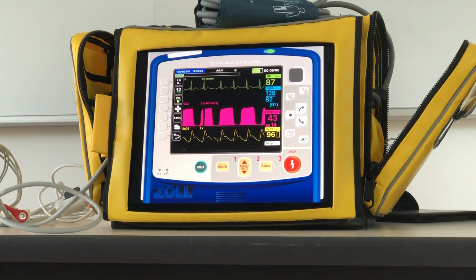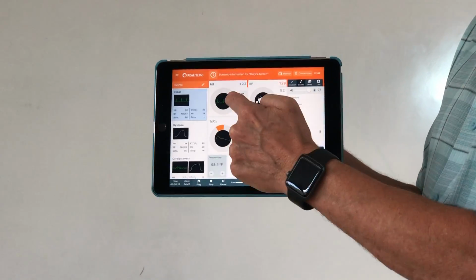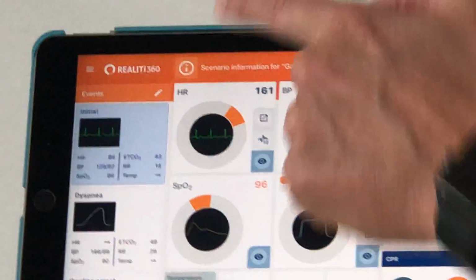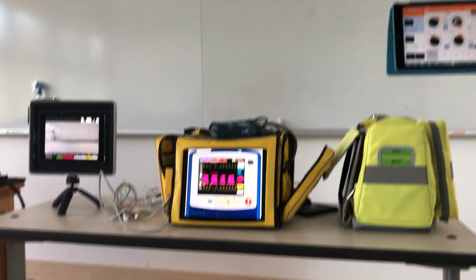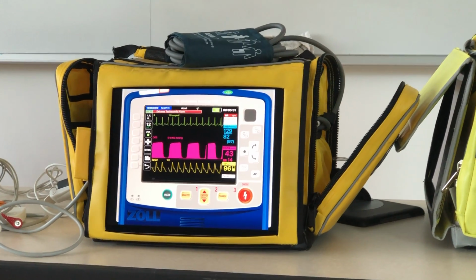With each of these, in these 4 center things, all the controls are done with a dial. So hopefully you can see, I grabbed the little orange thing and I can spin this up to 160 on the heart rate, and we're at, what, 87 now. So I have 2 choices. I can say, okay, they just did something, scared this patient. Right now I hit send and it just jumped to 167 instantly. Okay, real patients don't really do that typically unless you're making a rhythm change, right?